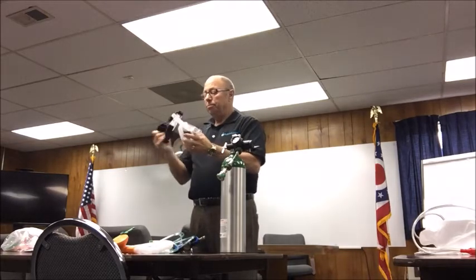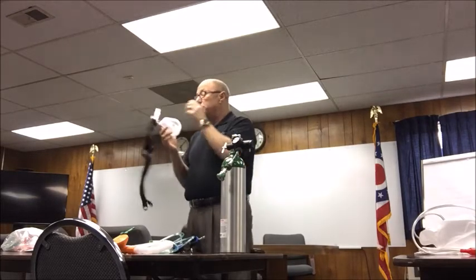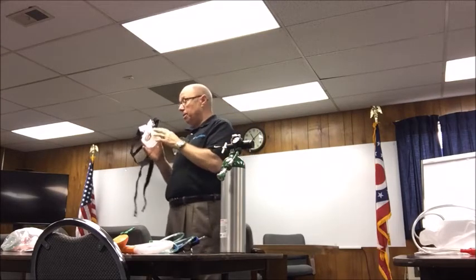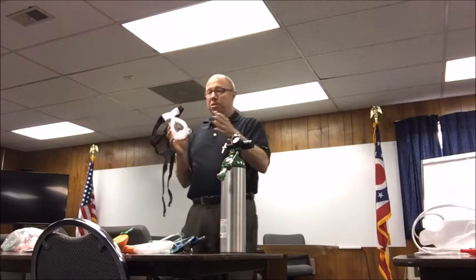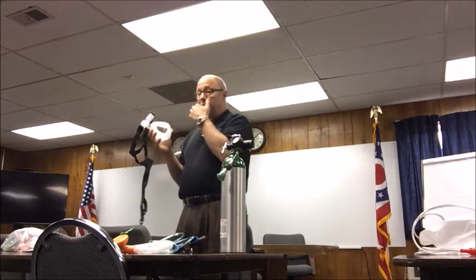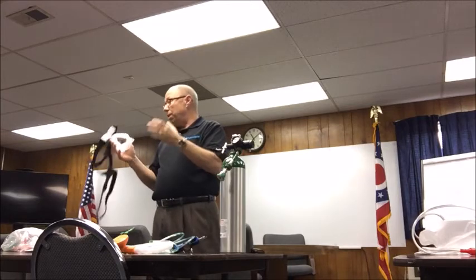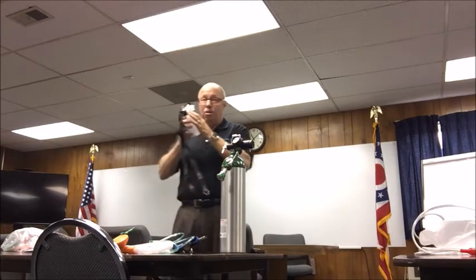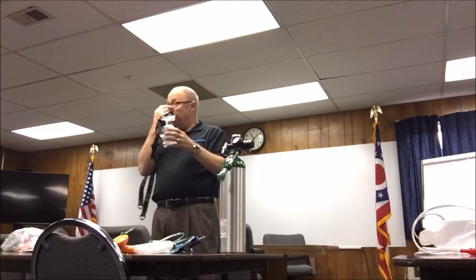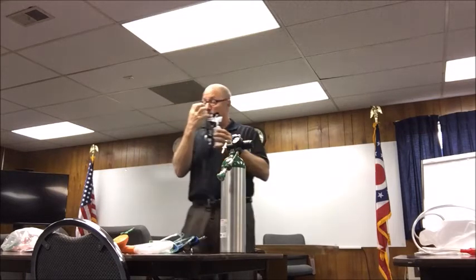The straps come attached, or the top straps come attached, as you see. What makes this mask so special is it doesn't take a lot of pressure to get a seal. One of the problems that I see across the country, from people transitioning from the Emergent to this mask, is with the Emergent, you remember that yellow foam mask. It required a lot of pressure to get a seal. You really had to crank it on the patient's face to get a good seal. And the reason why, the attachment point was right at his nose. So you couldn't really get up high or low without really putting a lot of pressure on it.